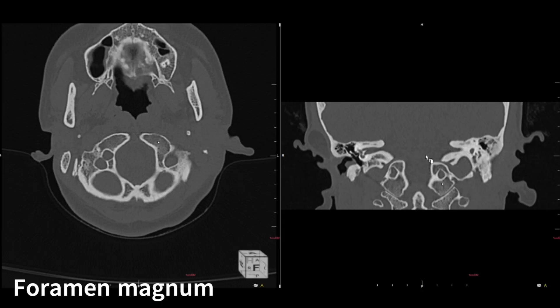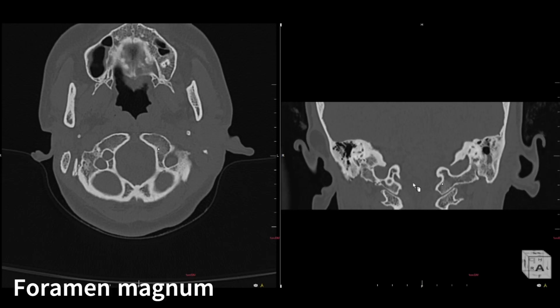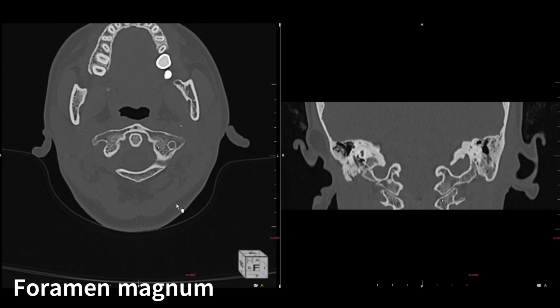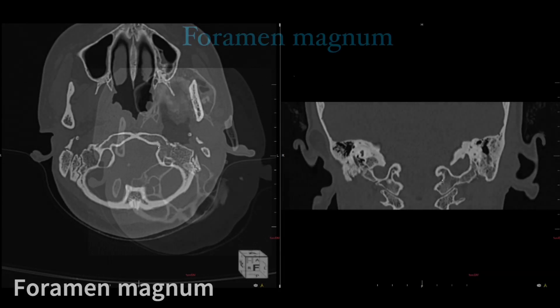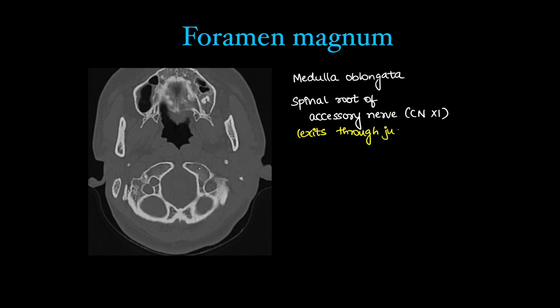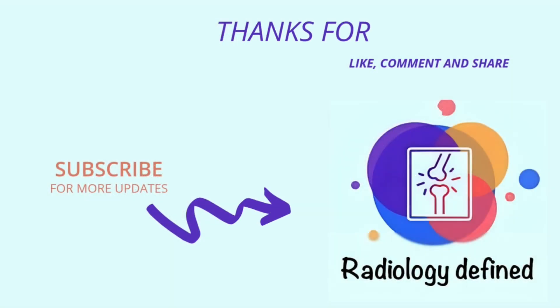On coronal, the foramen magnum is the craniovertebral junction. It contains the medulla oblongata continuing to form the spinal cord. It also has the spinal root of the accessory nerve — CN XI has two roots, and the spinal accessory nerve has a spinal root that comes through the foramen magnum and exits through the jugular foramen after joining the accessory part. The vertebral arteries come up through the foramen magnum, and spinal arteries pass down through it.